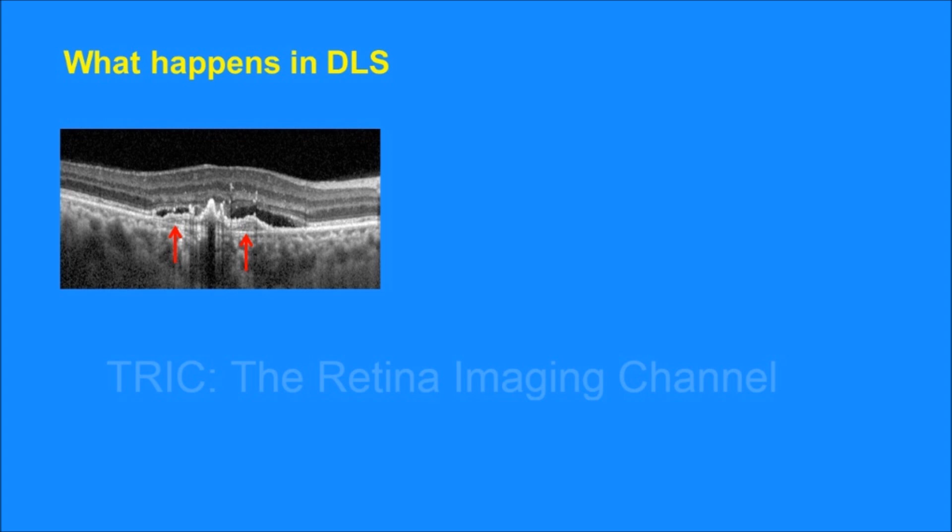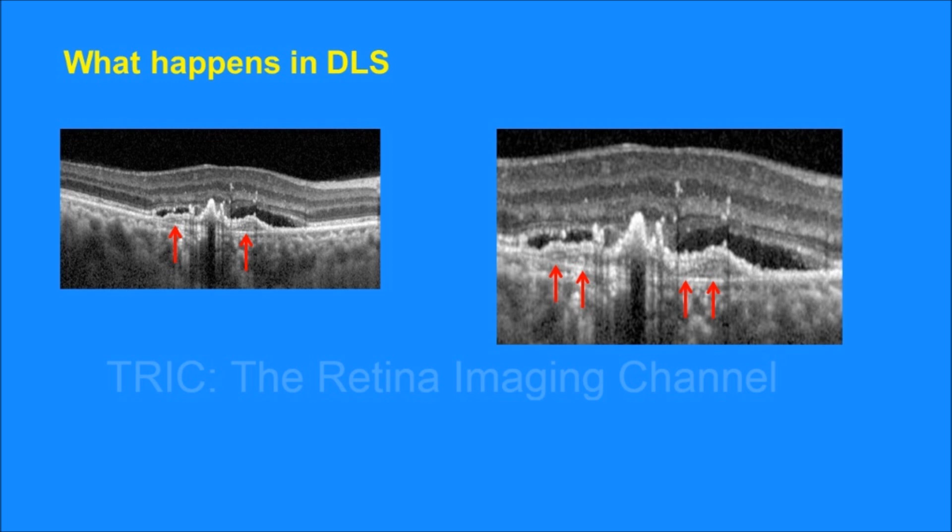Let's see how the DLS appears on OCT. In this image we see that there is an elevation of RPE. Now in usual PEDs there is no second line beneath the elevated RPE. But here in this picture there is a second line, marked by the red arrows, beneath the elevated RPE. This second line is called the double layer sign, and it has been created due to splitting of RPE from its basement membrane. The DLS is better understood in this blown out image.